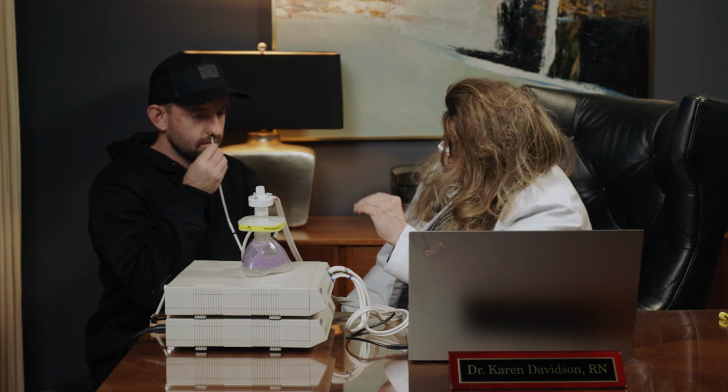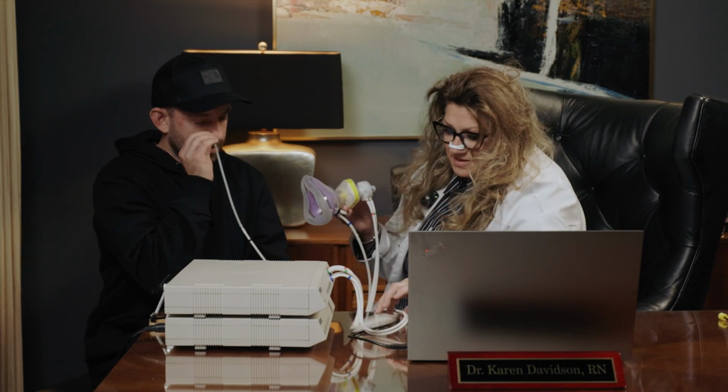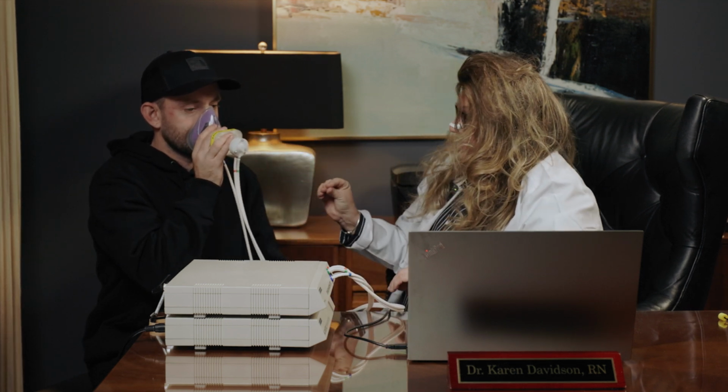It's going to expand a little bit, and then I want you to pinch the left side to see if you have a good seal. Now, there's 3 different sizes of foams. There's a peach colored one for kids, and we can do this in kids as young as 3 years old. In fact, they do this in Europe and Asia in young kids. Then we have a standard size, and then we have a larger foam size. What I want you to do is place the mask gently over your nose, right there. Keep your mouth closed during the test. You have a good seal? Okay, and we're going to get started.